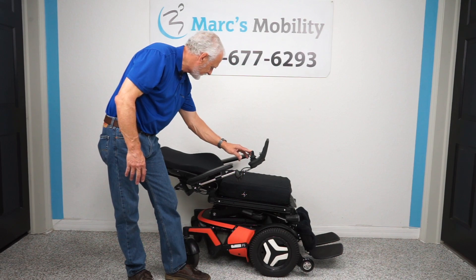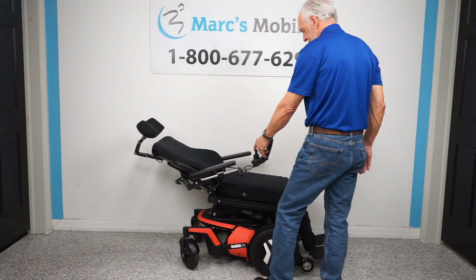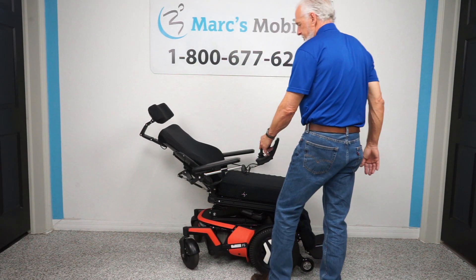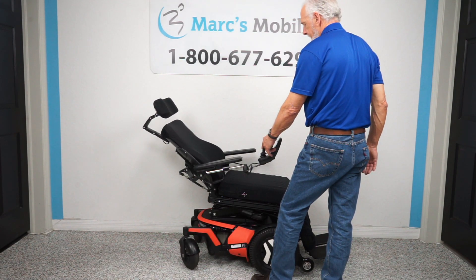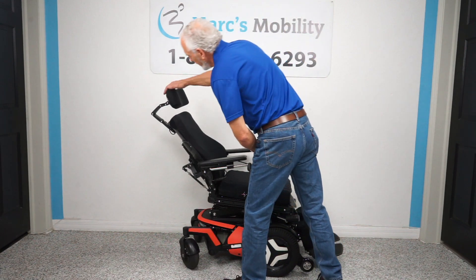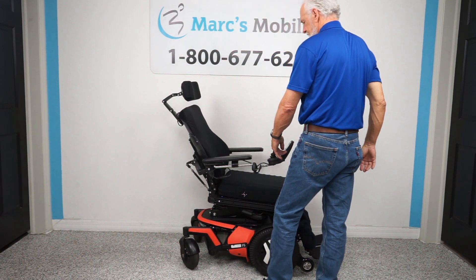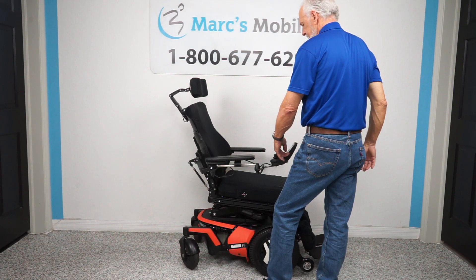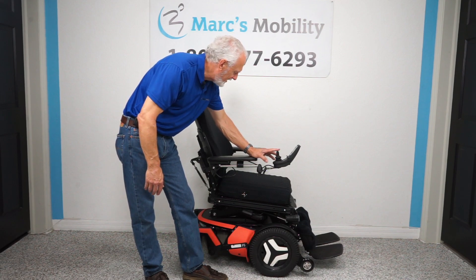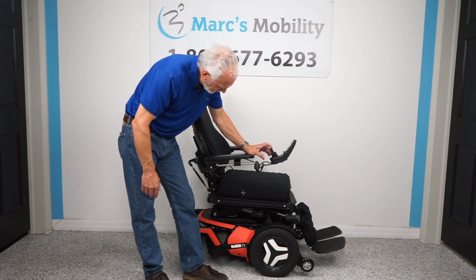Now I'm bringing the back back up — you can see the back coming back up. This chair also has an extra-large headrest. I'm going to bring the seat back to level so it looks normal.